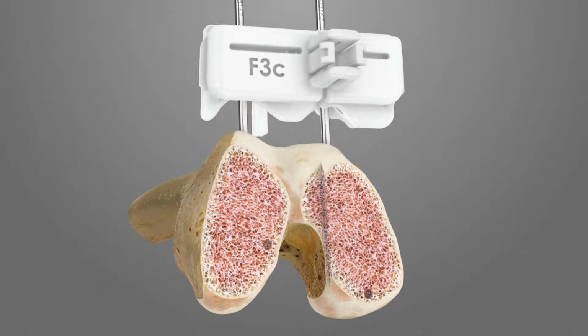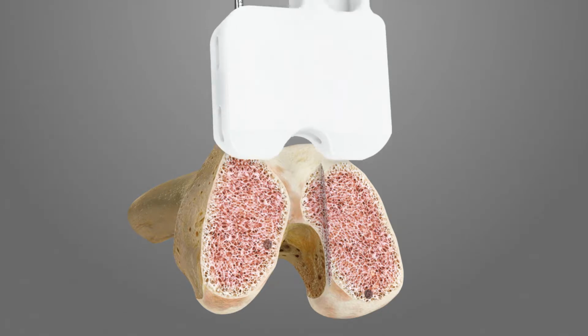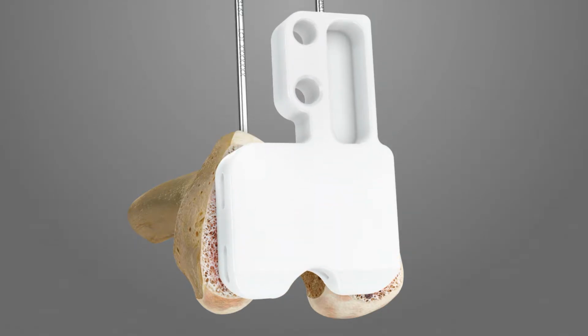Remove the F3C iJig. Place the extension spacer block, T2, onto the cut distal femur to confirm the cuts are planar. If T2 does not sit flat, revisit the cuts as needed.